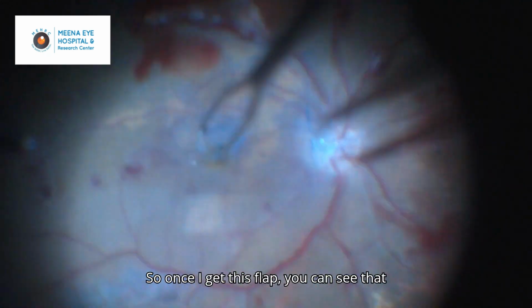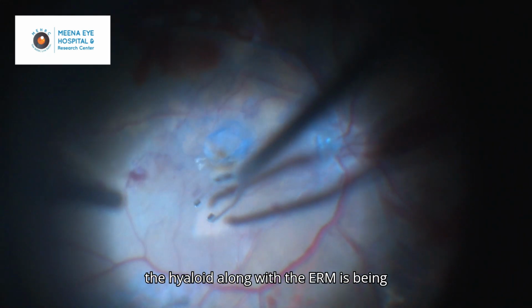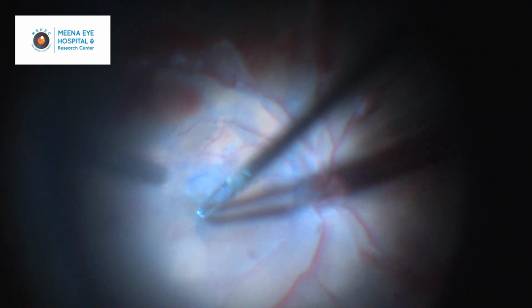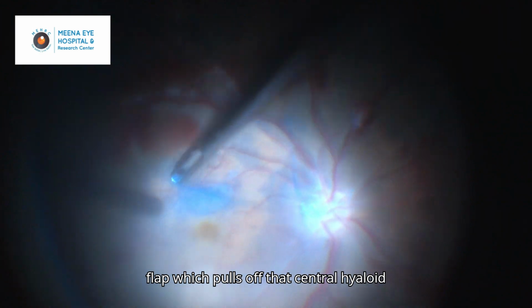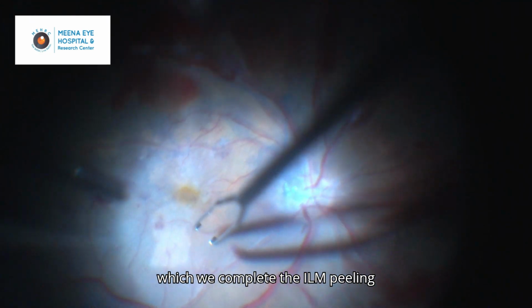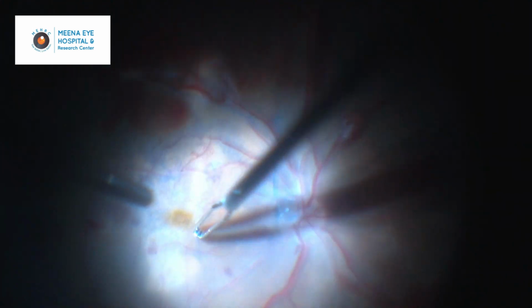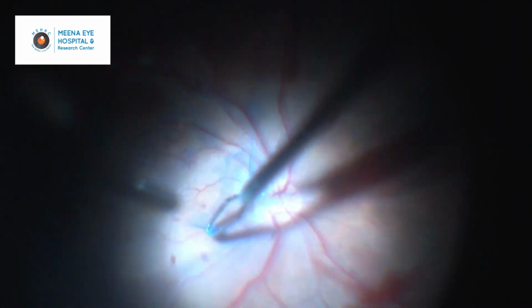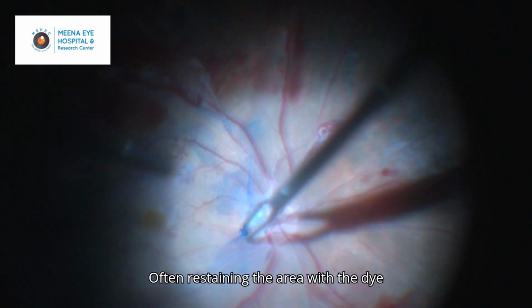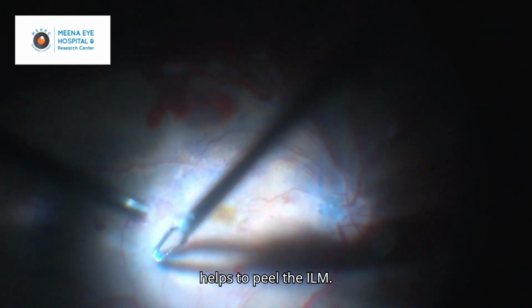So once I get this flap, you can see that the hyaloid along with the ERM is being peeled here in toto. This is the flap which pulls off that central hyaloid and the epiretinal membrane, following which we complete the ILM peeling at the central posterior pole. Often restaining the area with the dye helps to peel the ILM.